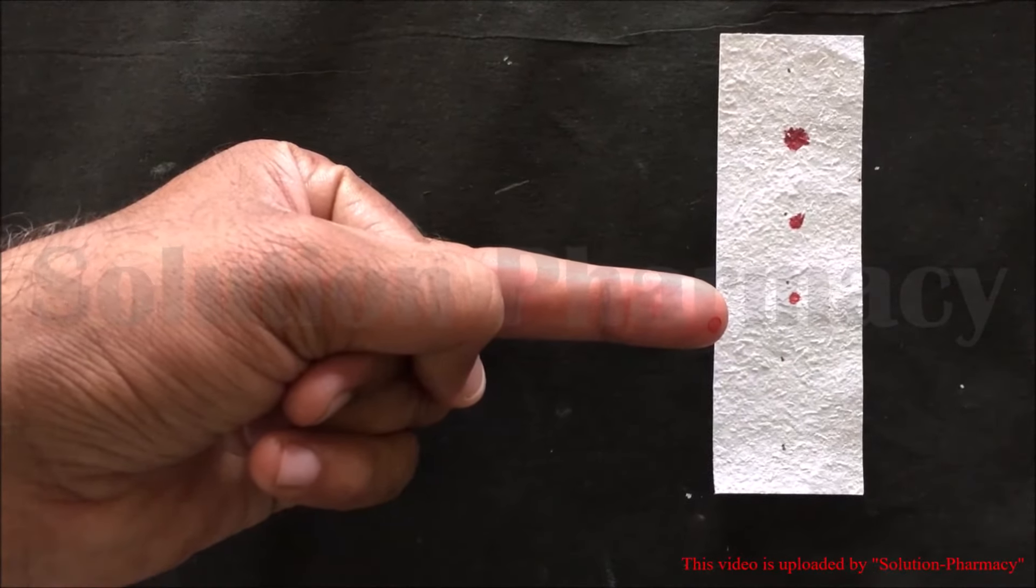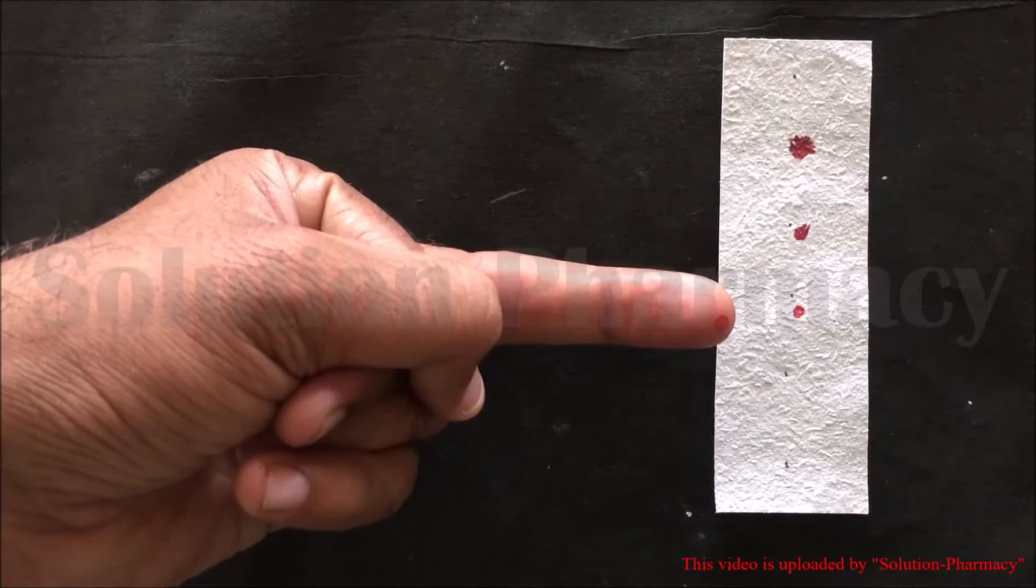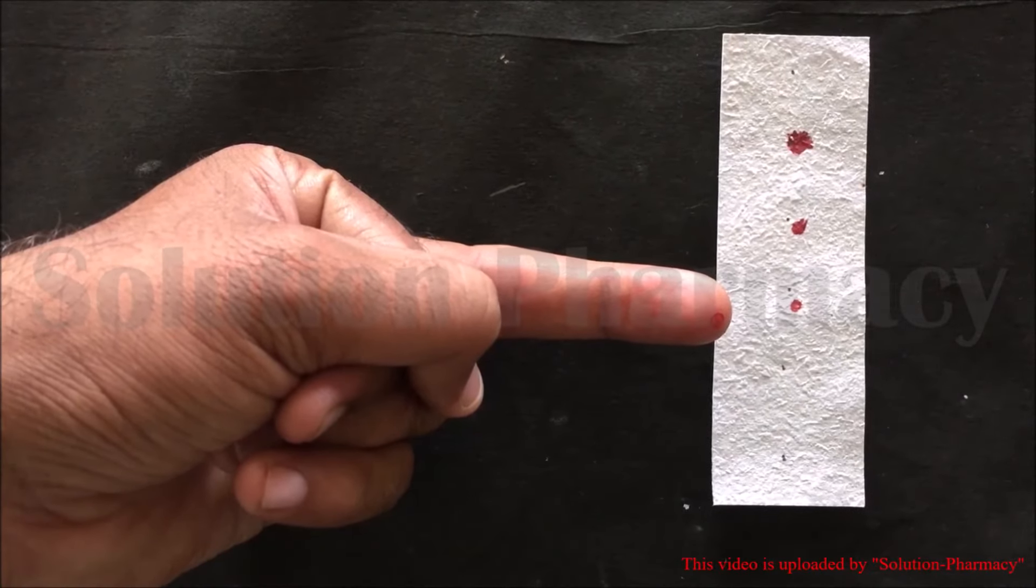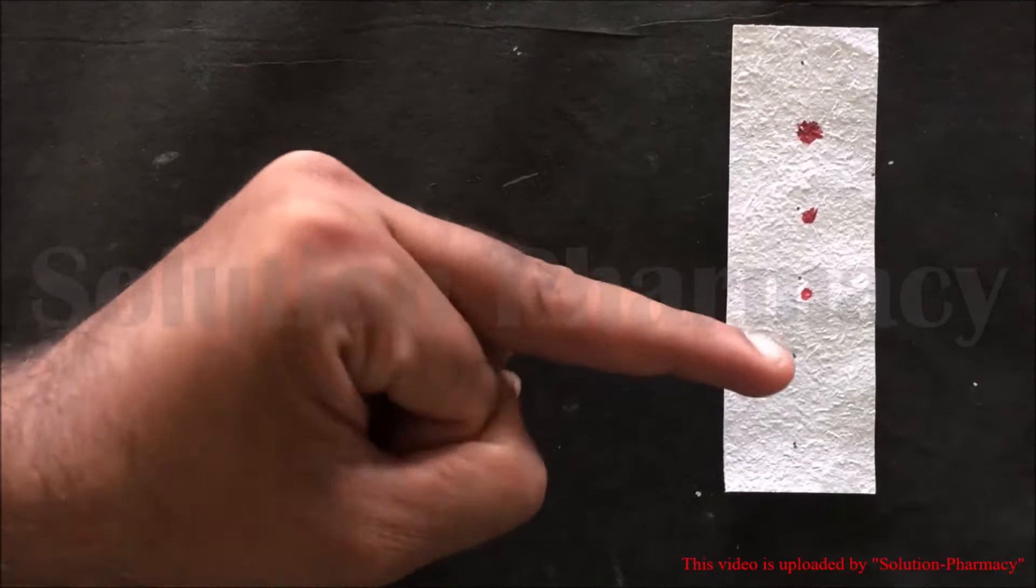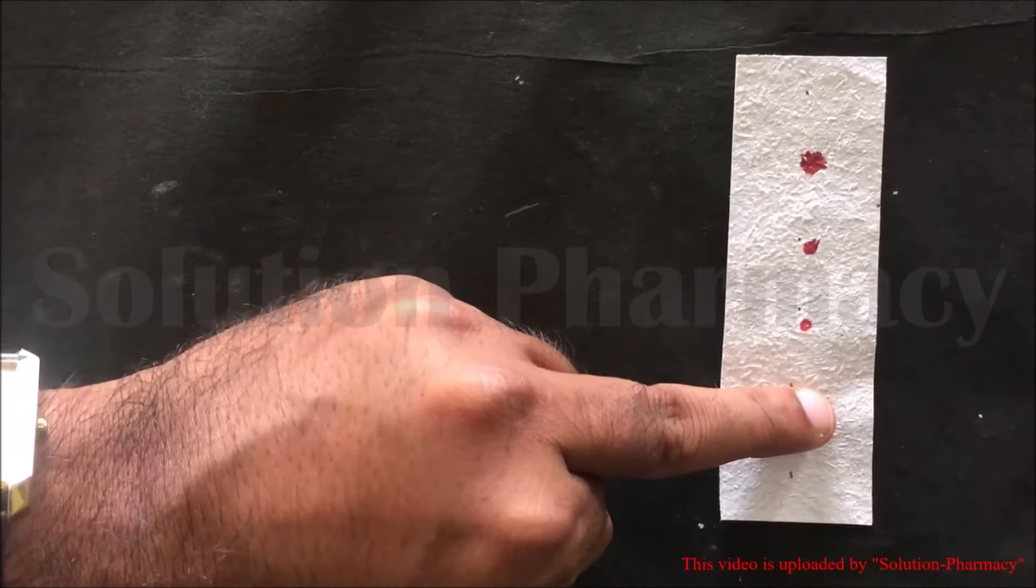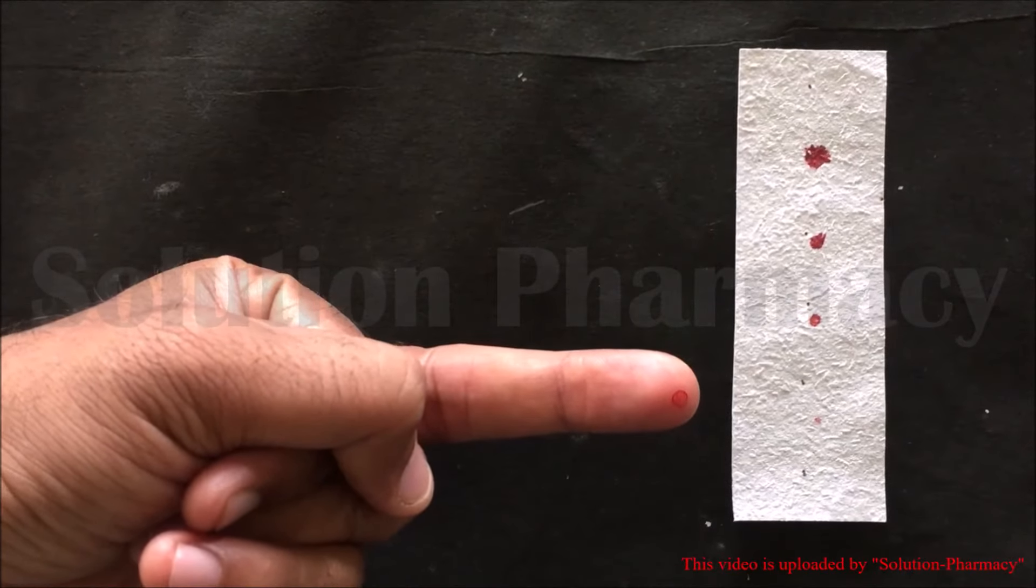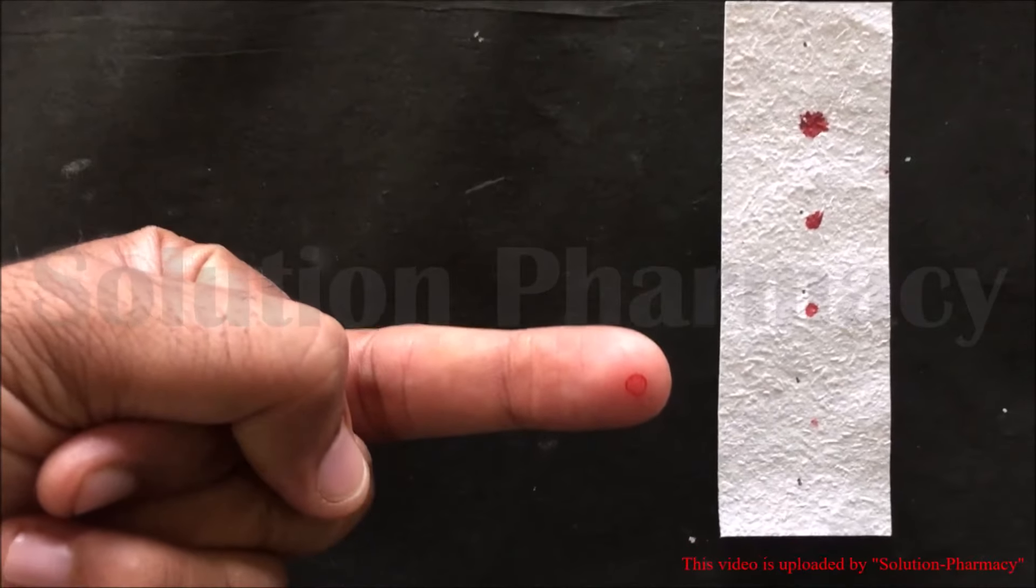Wait for 30 seconds and observe the filter paper after applying the fingertip where we pricked to see whether the filter paper stains with the blood or not. After 30 seconds, apply the fingertip over the filter paper. Here you can see a very minute spot appear on the filter paper.